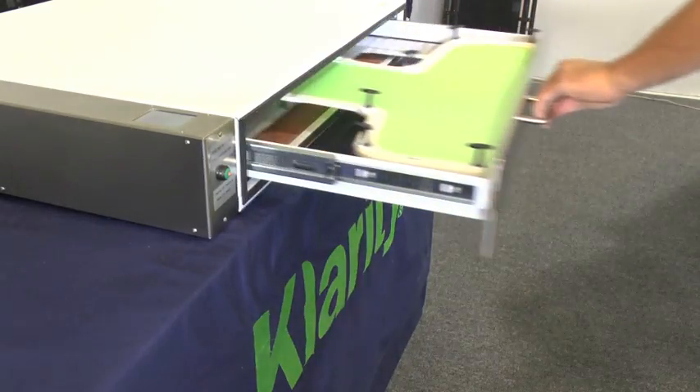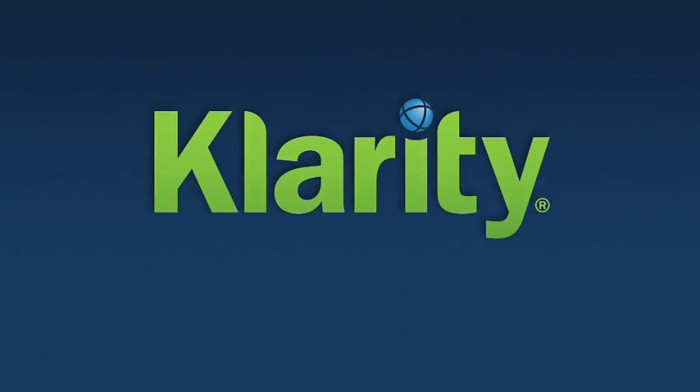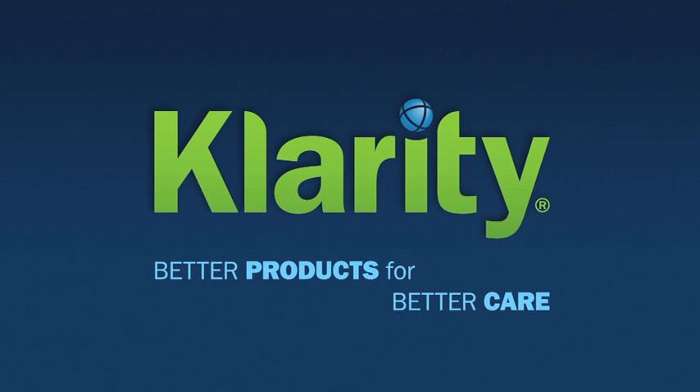Klarity Green is available for all standard systems — from S frames to U frames to O type and others. Klarity Green masks work easily in your water bath or in the new Klarity oven. You've tried the rest, now go with the best. Klarity Green masks: better products for better care.